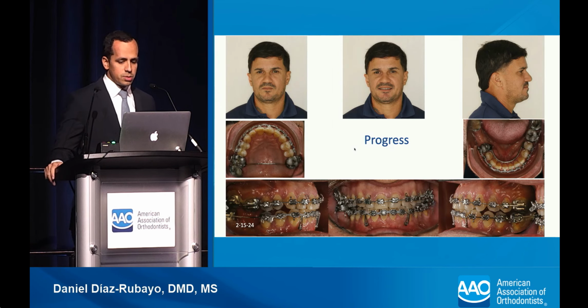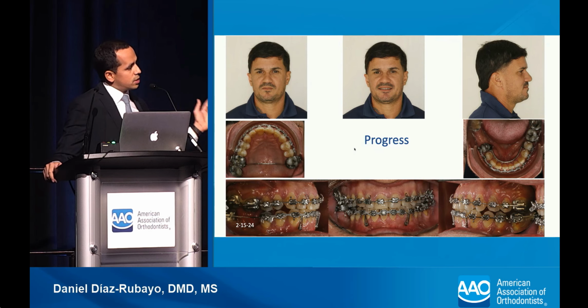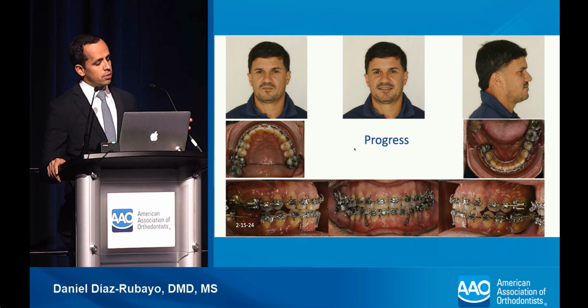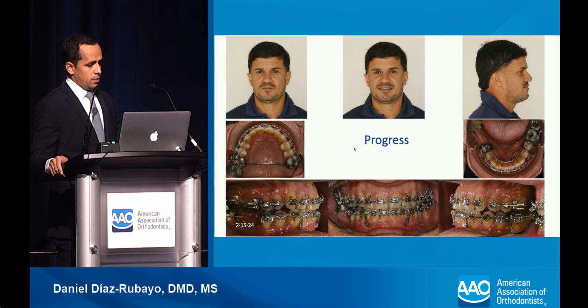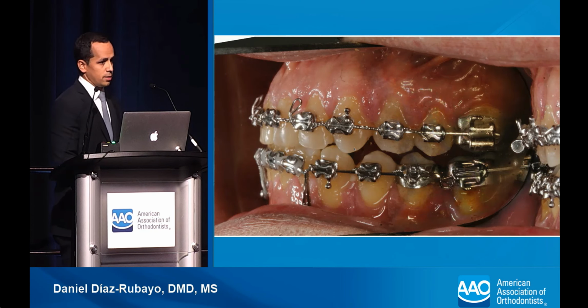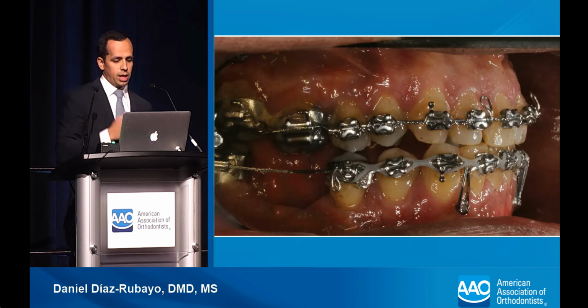So these are his progress pictures. We have not finished this treatment yet, but I wanted to bring you this case because we have recently started using more and more the cone beams to be able to document and bring you guys some pretty good information and see what we have. So these are his current buccal segments right now. You started with this relationship right here, and this is where we're at. From class 2 to class 1.